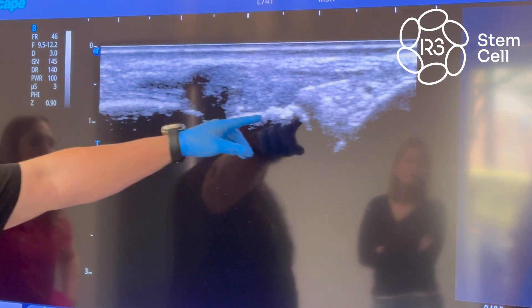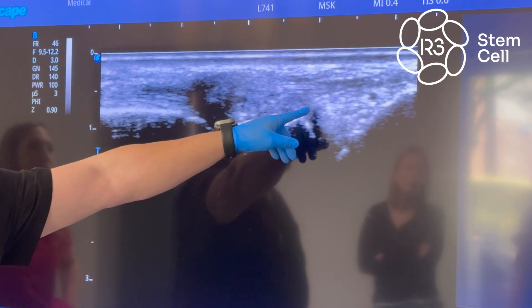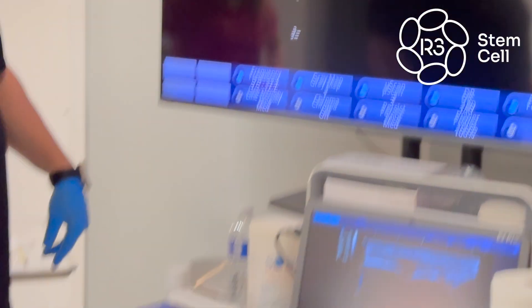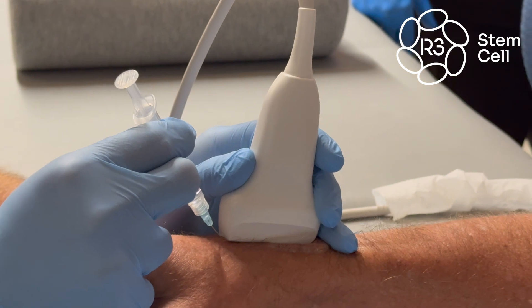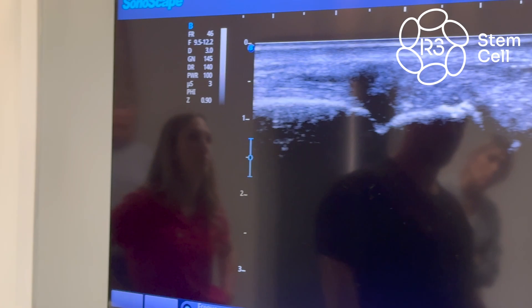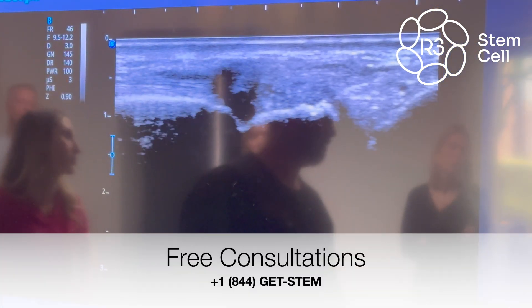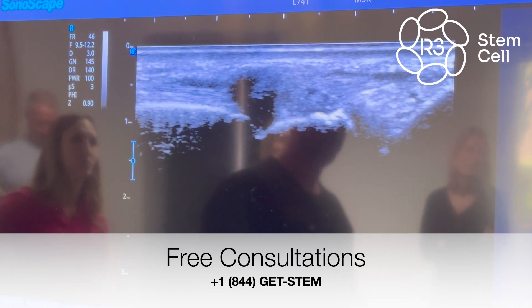Flood down into here. You can do one of two things: keep coming back a little steeper, or make sure your bevel is facing down — that's going to flood right down into there. That's a great shot right there. Whenever you're ready, go ahead and inject right there — it'll float down.